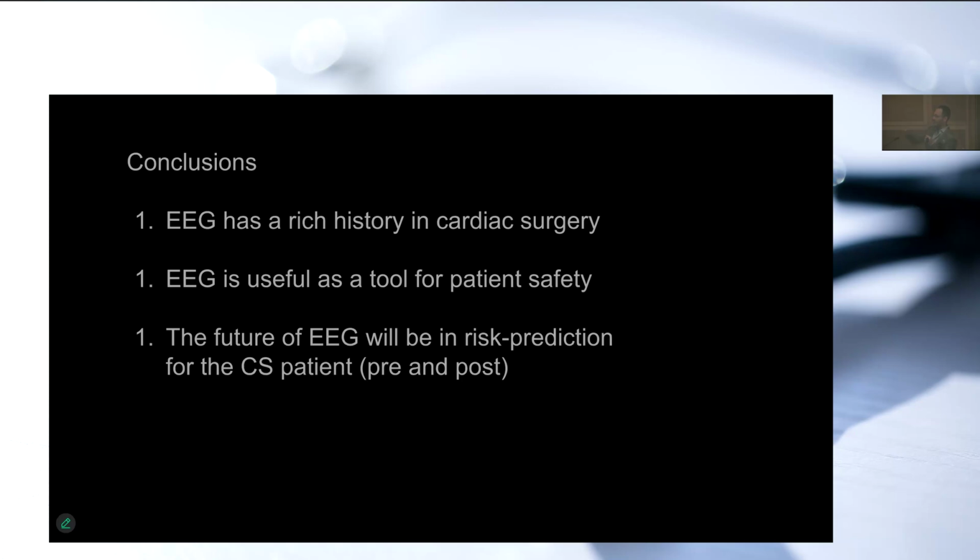But if I give you enough midazolam, eventually I will start to see the characteristic signature of midazolam, and that will not be sleep. And so we have this epiphenomenon where it depends on the brain state, but the brain state is driven by the drug that we give you to a degree. If we give you a tremendous amount of that drug, then we can get a different brain state. So that's another level of three-way complexity that makes the interpretations really, really challenging.